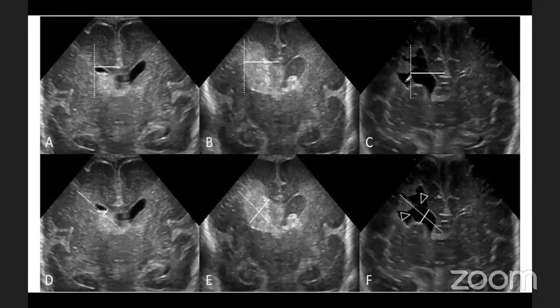And if you see here, these are some porencephalic cysts which coalesce with the lateral ventricle, and how difficult it is to measure the lateral boundary. But this is just like an imaginary line. Similarly here, when the hemorrhage is there, you just see the extent and measure the anterior horn width.